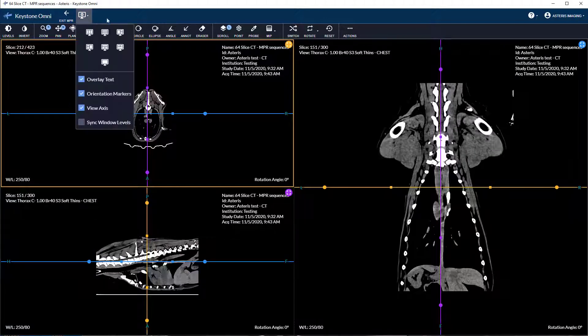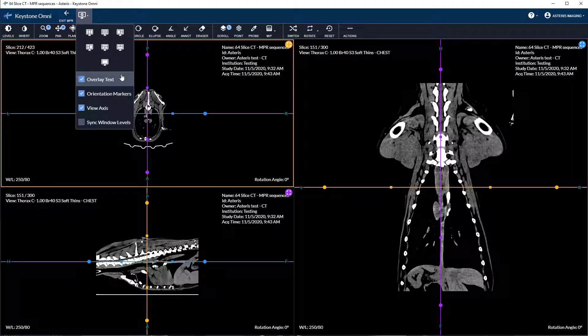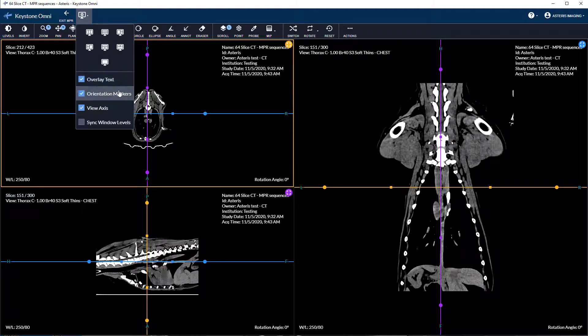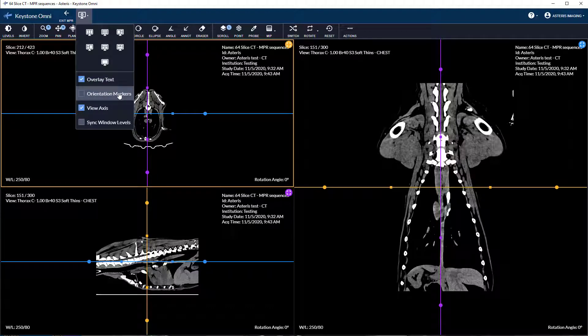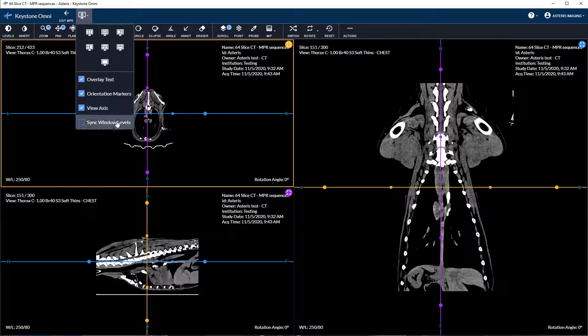Additional options in the viewer layout settings include toggling overlay text, orientation markers, view axis, and synchronization of windows leveling.